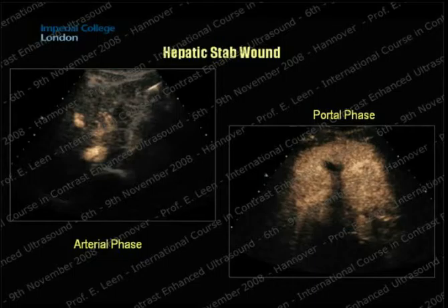I just want to show you a video of the laceration. You can see this is the arterial phase here. We see this stab moving through into the liver. And while you wait for the late phase, you can see quite clearly this area of laceration or hematoma. And you could also track and see whether there's actually active bleeding by doing a second re-injection if you need to.